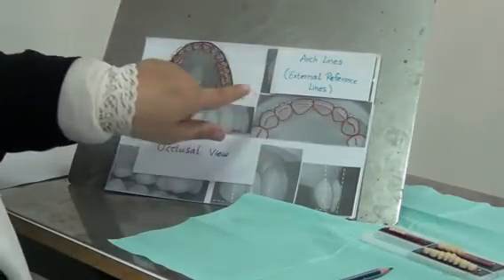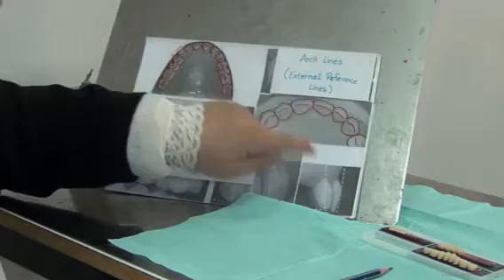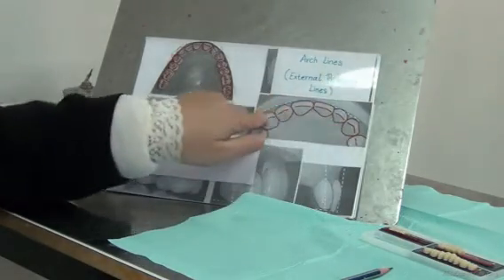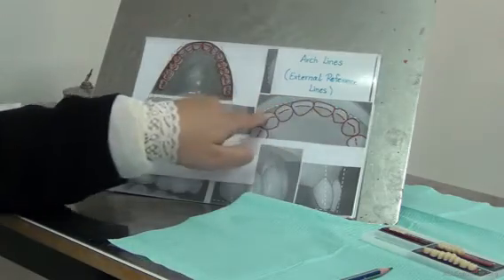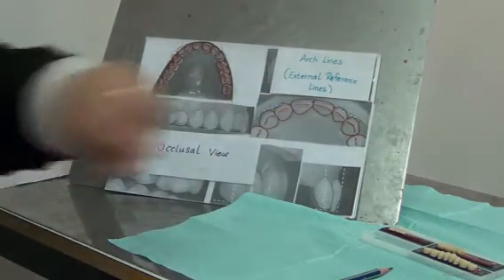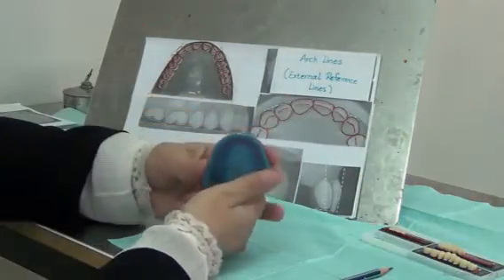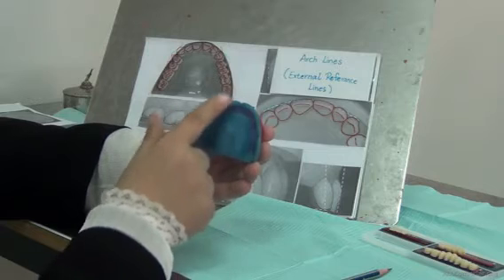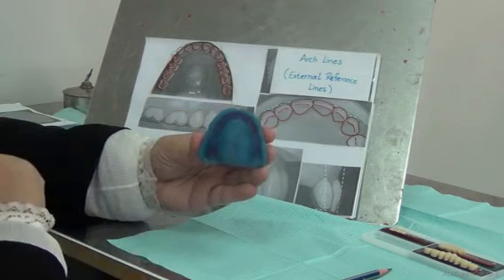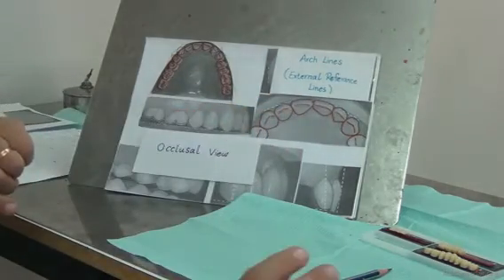So we always compare our setting with the lines. We have external lines, and we call this the arch line of the anterior teeth. The teeth from canine to canine should follow this line and be not more than it when looking at it. I could also notice that if I take this out and even invert it and look at it from the side, when I see the sulcus recorded in the base plate, none of the teeth are appearing from behind the setting. So the teeth are set inside that arch line.